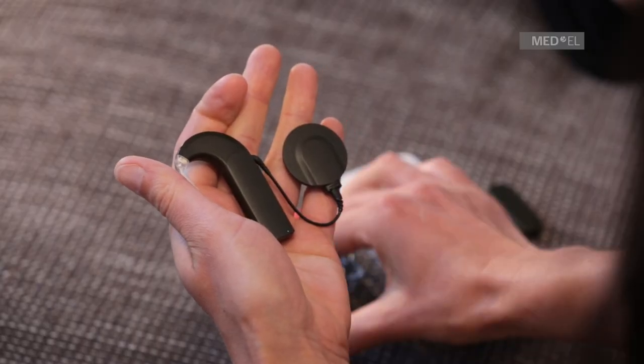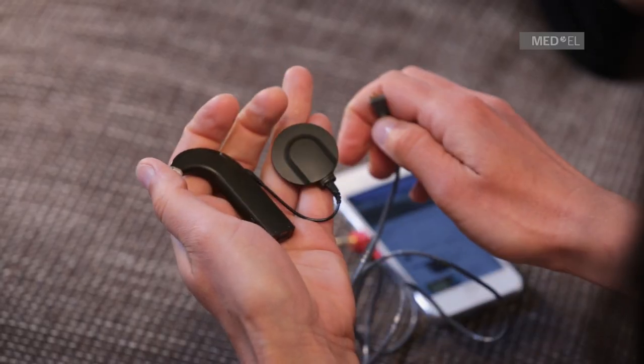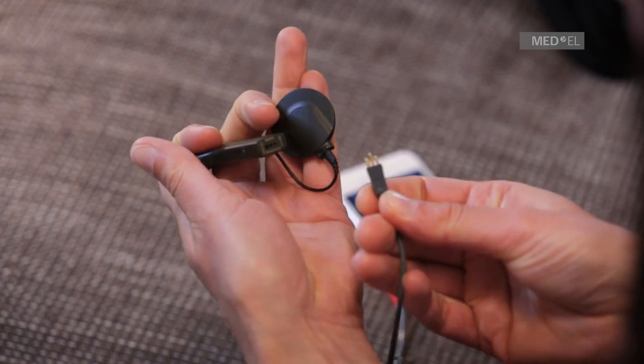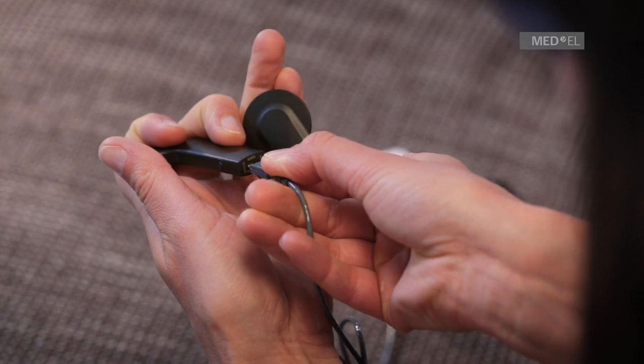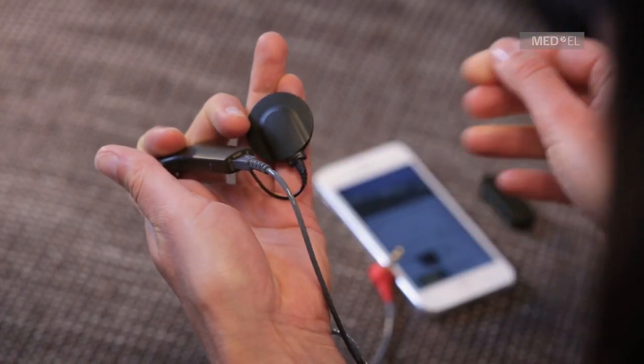Insert the 3-pin plug of the audio adapter cable into the FM port and the 3.5 mm plug into the headphone port of the audio device. Sonnet will automatically detect sound signals.